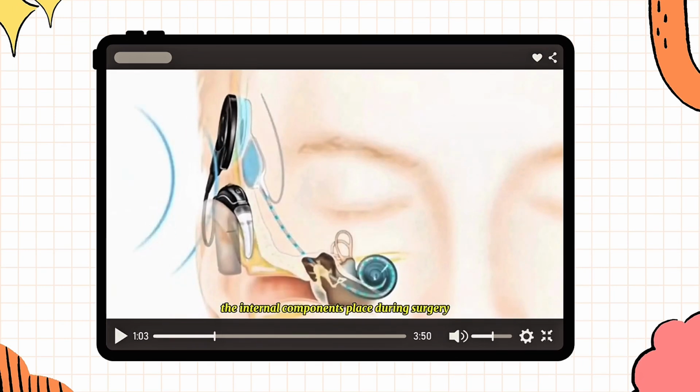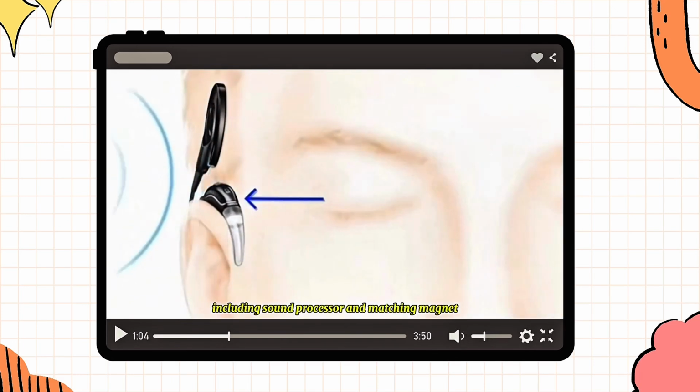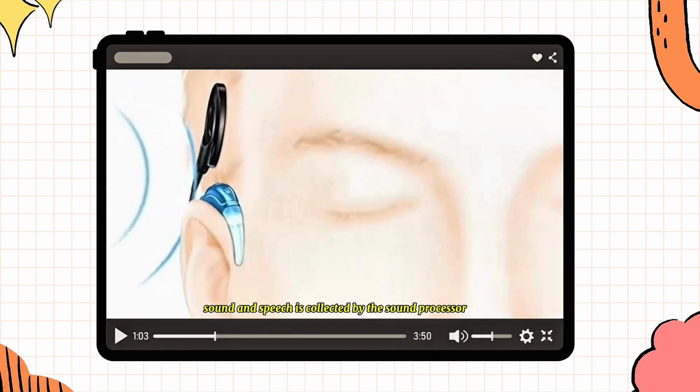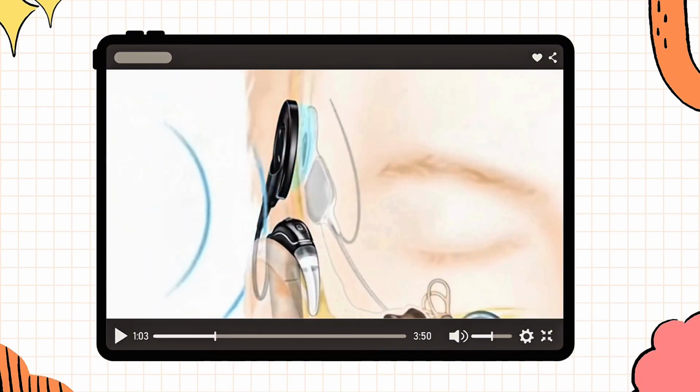electric impulses. Today I'm going to talk about cochlear implant. The cochlear implant is a remarkable piece of technology made up of internal and external components. The internal components placed during surgery consist of an internal magnet and electrode array. The external components are worn above and behind the ear, including sound processor and matching magnet. Sound and speech is collected by the sound processor and turned into a unique pattern to be sent to the electrode array in the cochlea, your hearing organ.